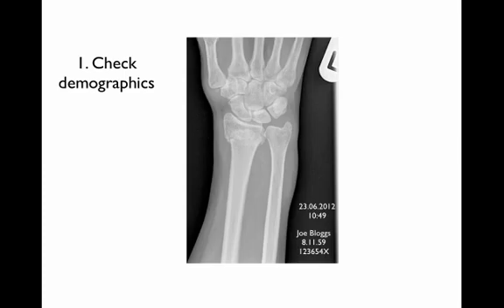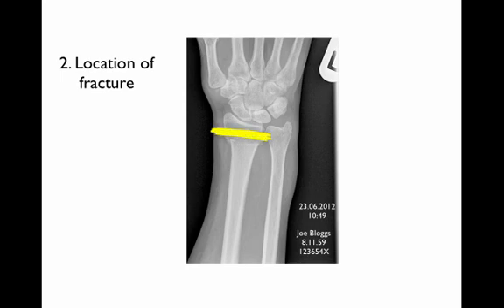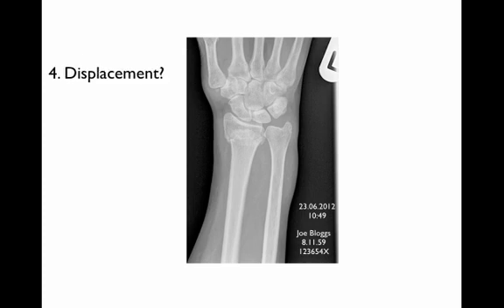Now we'll put this all together with some common examples. First, we check the demographics: this is a wrist x-ray of Joe Bloggs, taken on the 23rd of June 2012 in the morning. The location of the fracture is the patient's left wrist, in the distal third of the radius. The type of fracture is transverse. To accurately describe any displacement, ideally you should have a second view, as in this case.